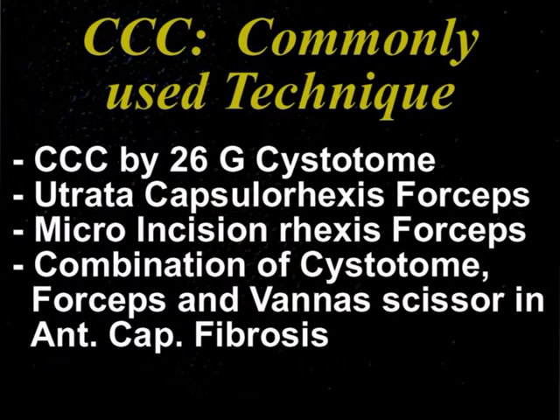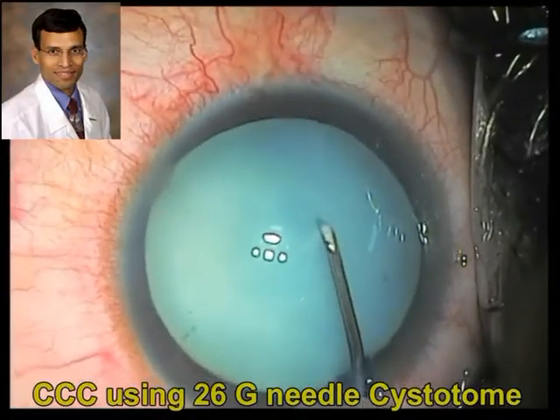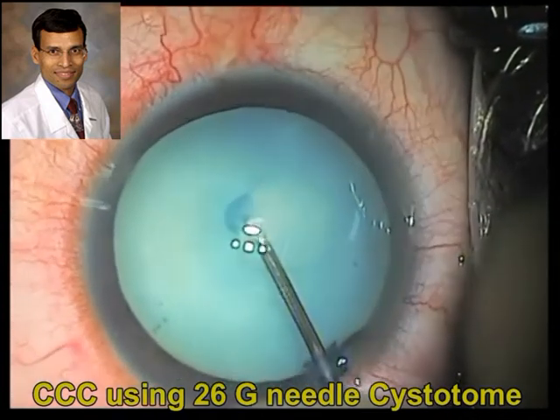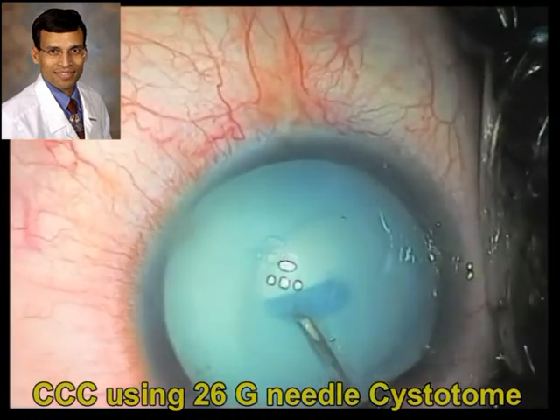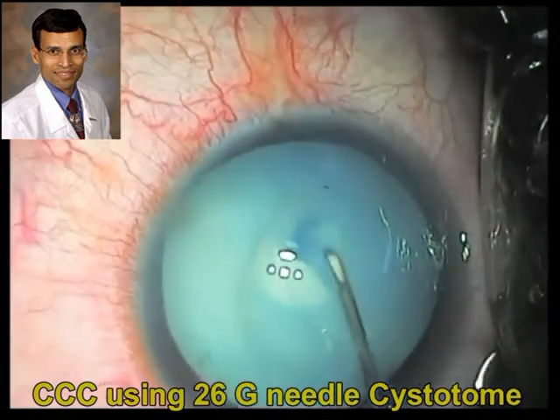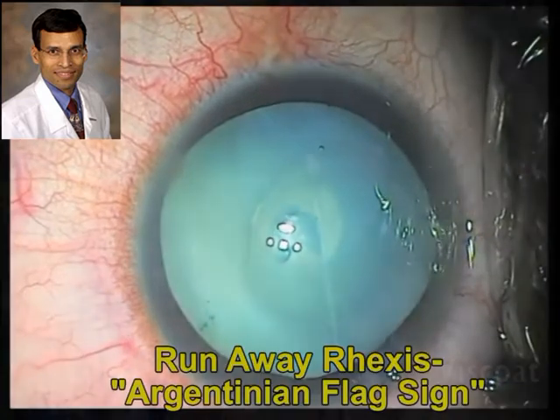The common techniques for achieving a capsulotomy include cystitome, capsulorexis forceps, micro incision CCC, and others. They can be used in most cases, but it is quite difficult to achieve a rexis in mature cataracts and white cataracts with anterior capsular fibrosis. As shown here with a trypan-blue-stained white cataract, using a cystitome results in a difficult, poorly controlled rexis that ends up very small and is not uniformly reproducible.